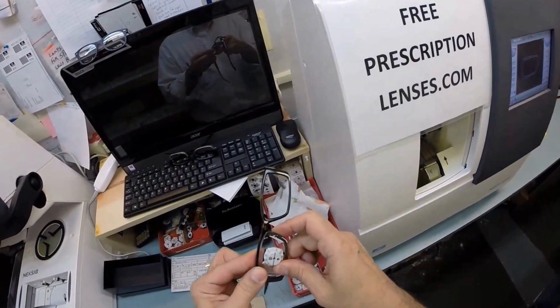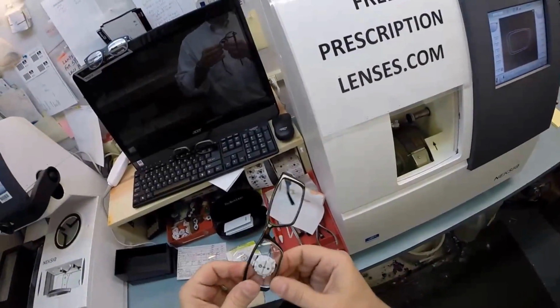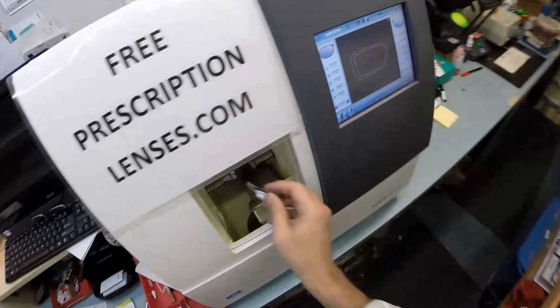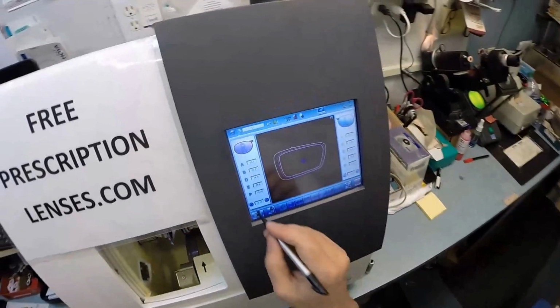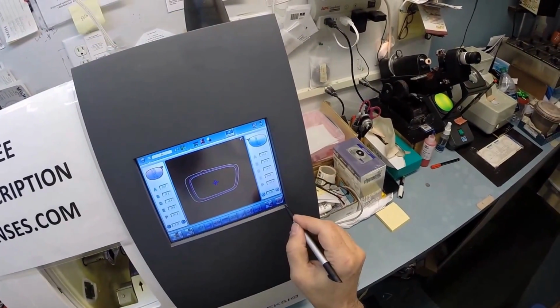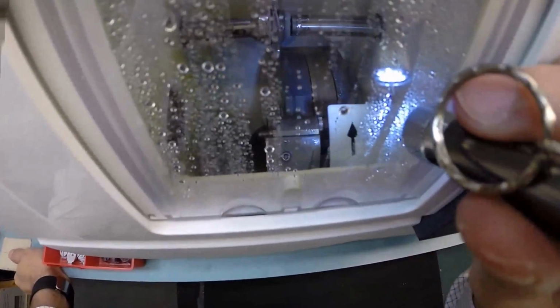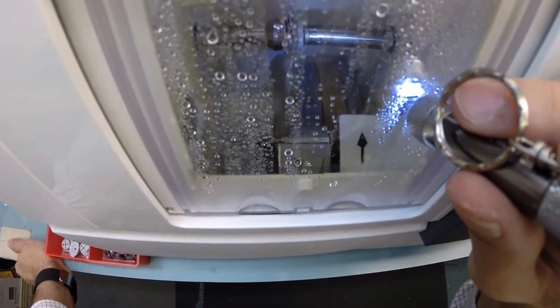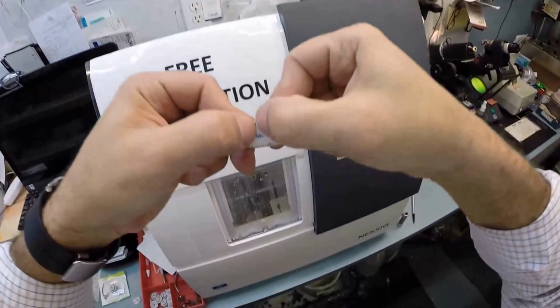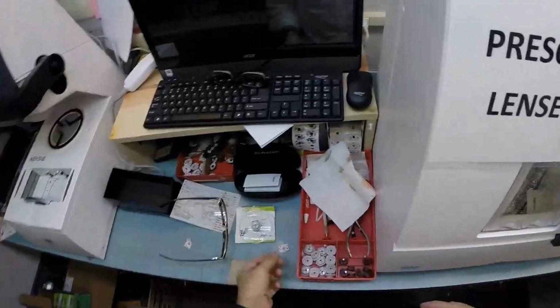So I'm going to tuck it in at the outside corner closest to me, push down with my thumbs, and it's still a little bit large, so I'm going to take it down a little bit more, put it back in, and I'm going to take it down just due to the thickness about 1/4 of a millimeter, and I'm going to hit the retouch cycle. Now this time it's just going to go back onto either the bevel wheel or the polishing wheel, possibly both. Now everyone in America has no clue what 1/4 of a millimeter is. So a millimeter is the distance between my thumbnails. I'm going to take 1/4 of that distance off, going around the circumference of your lens until it snaps into your frame easily.